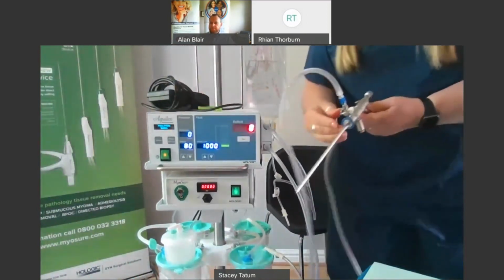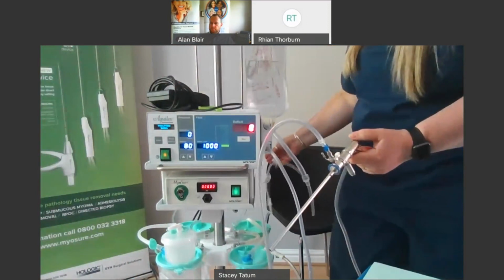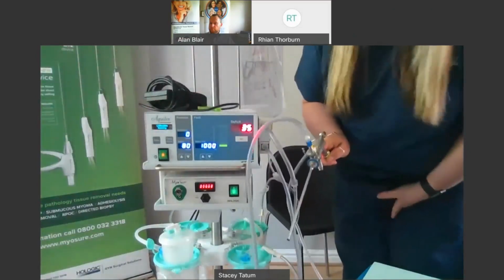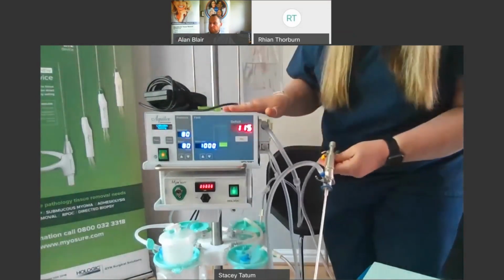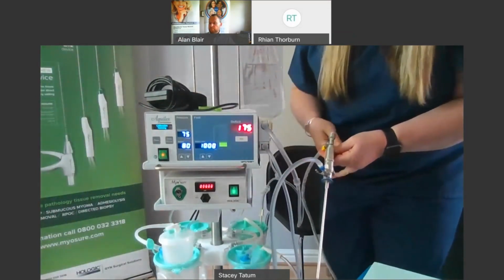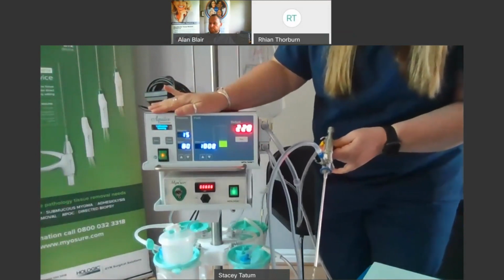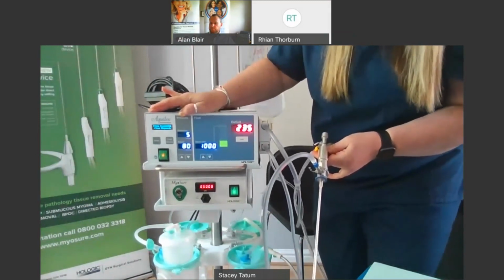So to prime, you will need to ask the surgeon to open both their taps. You need to make sure that your bag has been unclamped and then press the prime key. Now the surgeon needs to hold the scope roughly at the height and the angle that they're going to go in at. If I was looking at this machine, I'd be making sure the fluid was going in and that it was coming back. The fluid will start and stop, as you can see, but the machine will let you know when the prime has been successful. When it does, it will ask for the blue stopcock to be closed.